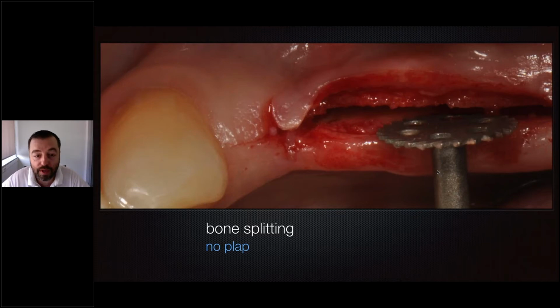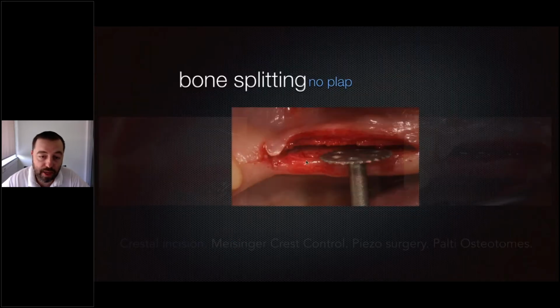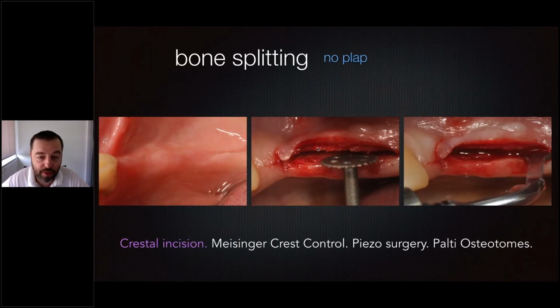So what we do is only a crestal incision that you see, just a crestal incision. And basically, we don't raise any flap at all. So just a crestal incision and only like 1.5 millimeter deperiostation here, just to see the edge of the ridge, and such as we are able to cut it. We can cut it with a disc, and we can also cut it or continue the cut with a piezo surgery, of course.